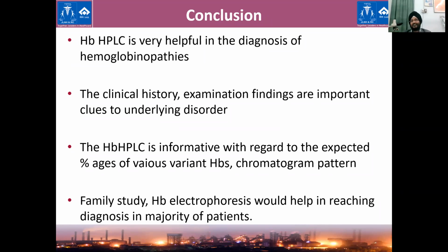The difference is that certain hemoglobin clusters can be differentiated, say S, D and G. D means D Punjab. We can separate them using acidic electrophoresis, and they will go in different directions. But the problem is that A2 and E again travel together, and it is very difficult to say what it is.